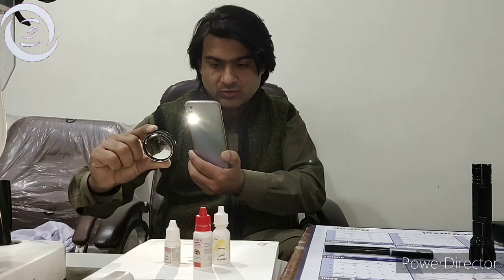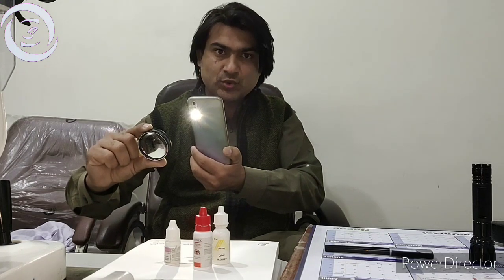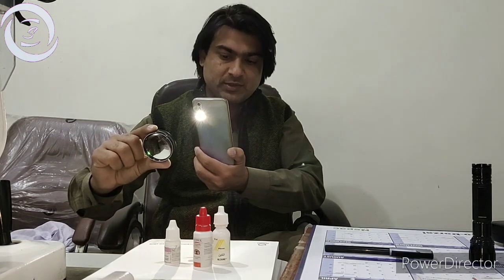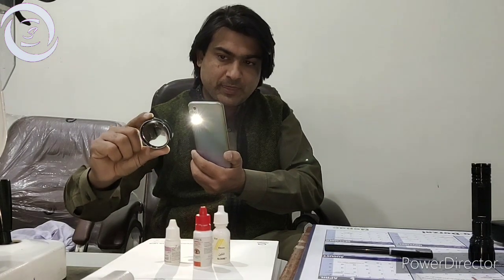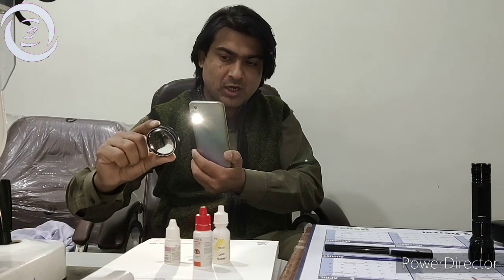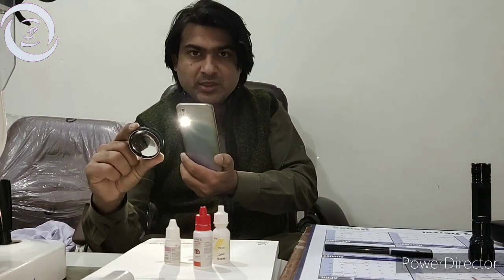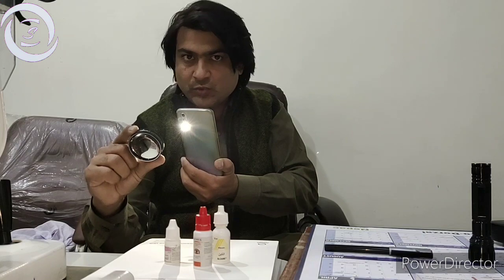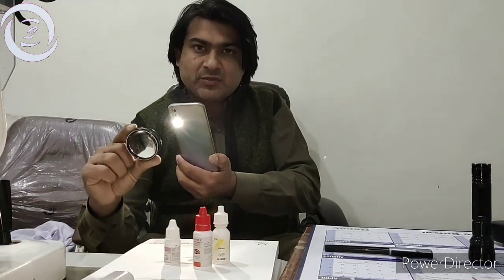This way you can make videos of the area of interest, like the macula or optic disc. You can also tell the patient to look up, down, medial, or lateral in order to get pictures of the desired area.